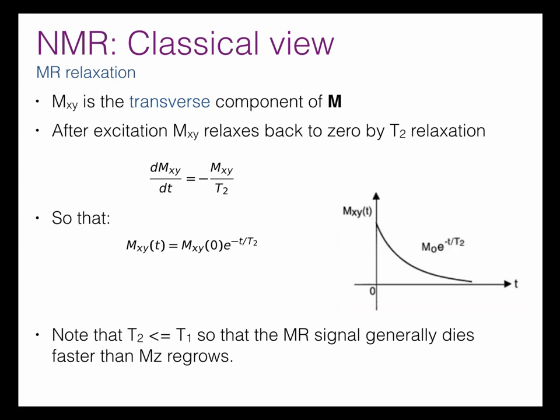And that's a little bit unlucky, because we would like to be able to use our MR signal for as long as possible. And then when we've finished using it, we'd like to be able to scan again. But unfortunately, our signal dies away, and it might be some time after the signal has died away before we can run another experiment.